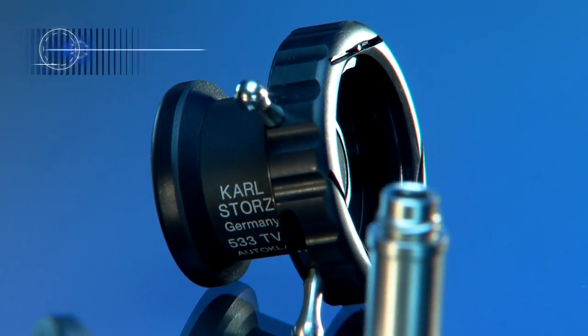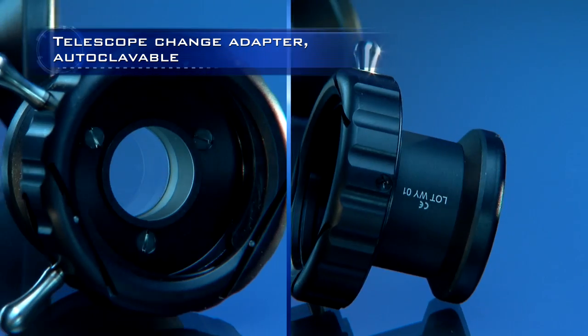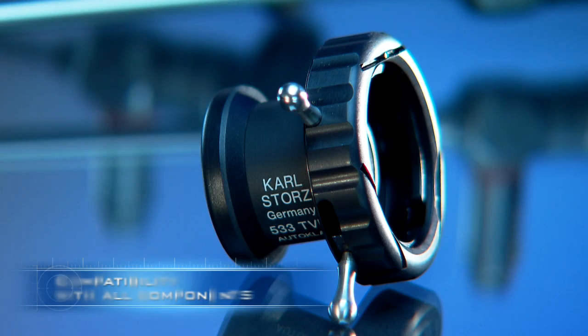The Karl Storz telescope change adapter allows quick and simple changing of the telescopes under sterile conditions. Thus the telescope port is available for the use of special instruments if necessary.